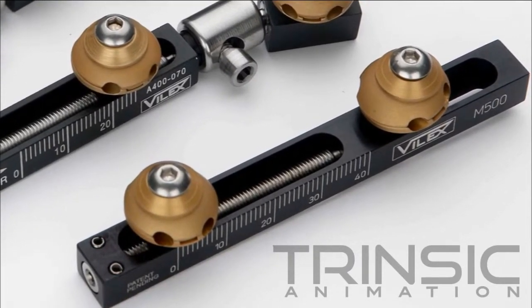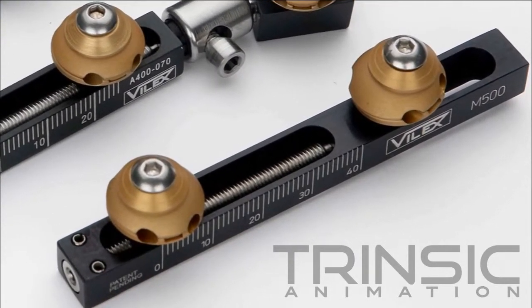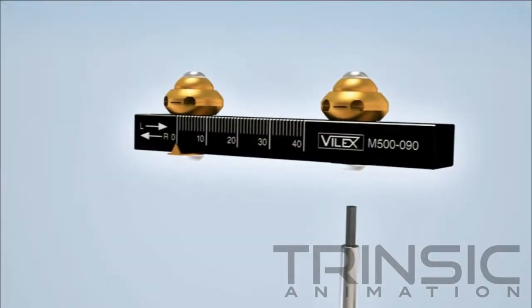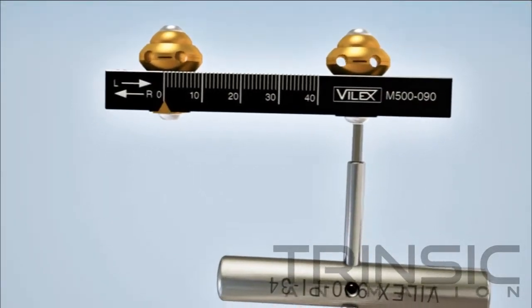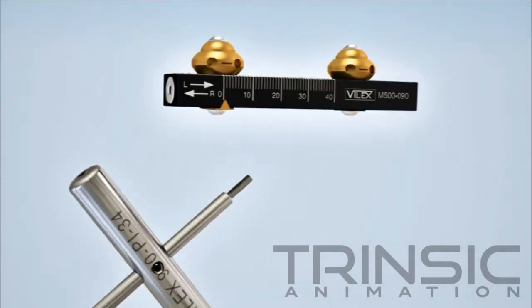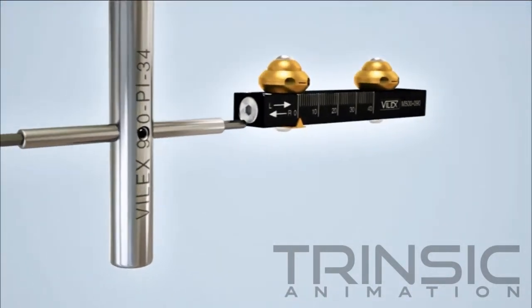The first step is to decide on the sizes of the rail and half-pins and the positioning of the half-pins. We prepare the selected rail by loosening the stationary carriage and repositioning the traveling carriage midway along the rail.